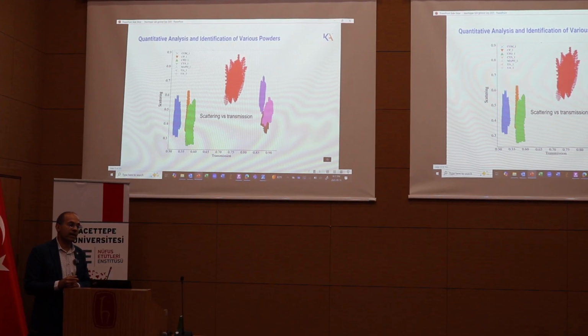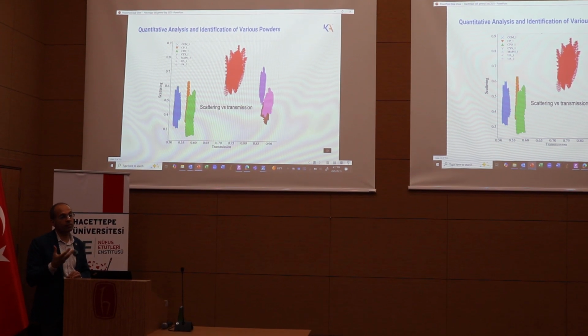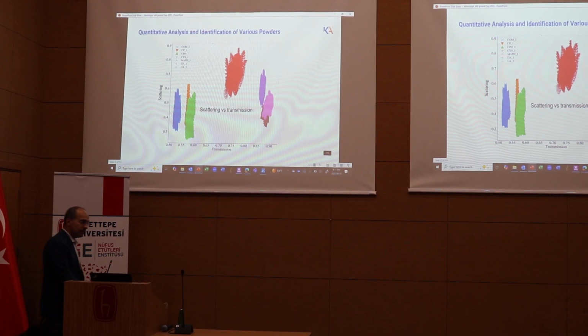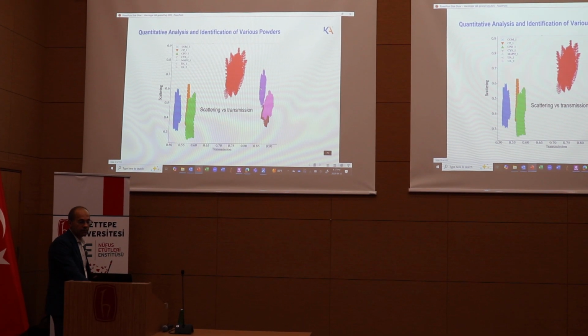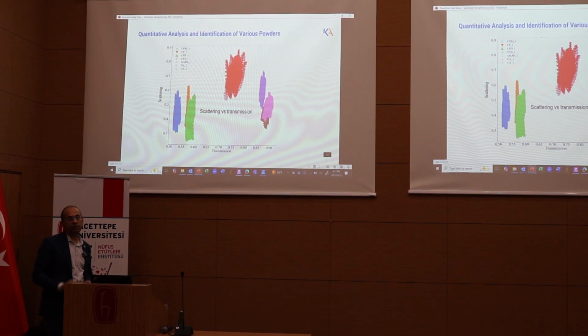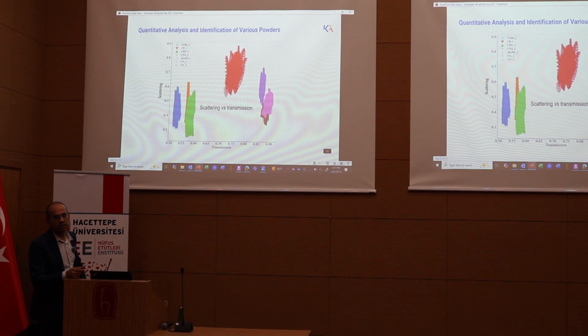You might think it's uric acid because uric acid happens to be much more common. You have to do spectroscopy if you want to find this. But with X-ray, for the first time, the scattering information, magnesium powder scatters differently from uric acid. It allows you to differentiate between magnesium and uric acid, right? So this is another advantage, a quantitative element, if you will.